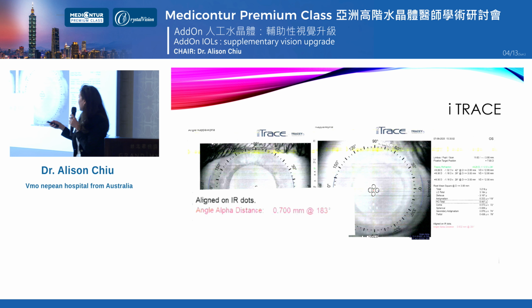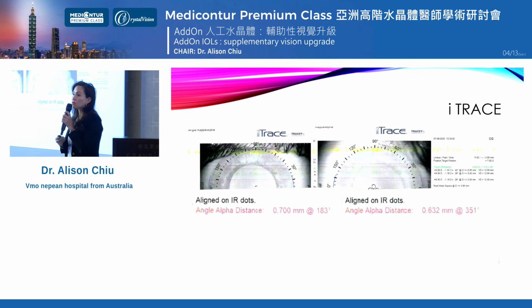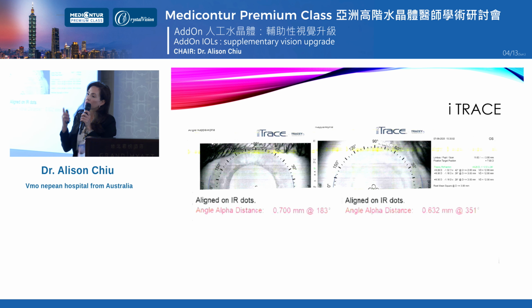So really her only choice, and this is the eye trace, and what it's showing here is the angle alpha. The angle alpha is high, it's 0.7, 0.63. That is something that I do look at when I'm choosing my multifocal suitabilities. But she was desperate to do something. She's wearing these thick Coke bottle glasses, can't tolerate contact lenses.